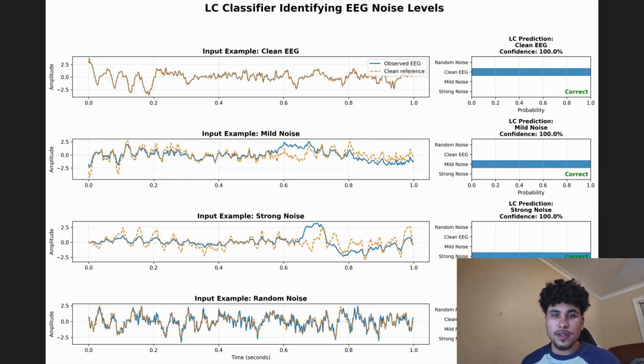One quick thing to note is this new updated pipeline no longer attempts to denoise the entire signal. Basically, I added a clean signal bypass to the LC part of the pipeline. What that means is any data detected as clean by the LC classifier is no longer denoised. Now, this is useful because it no longer denoises clean parts of the data that may have important features for intention classification later down the line, which is super important for identifying whether someone wants to open or close their prosthetic arm.